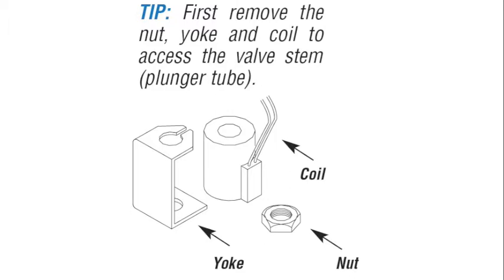Once disconnected from the power, remove the nut, yoke, and coil.